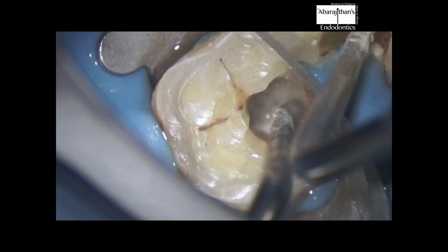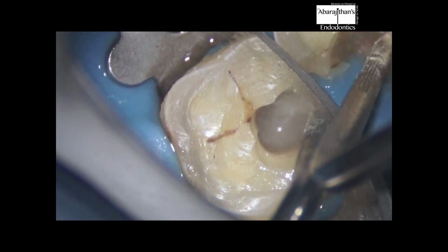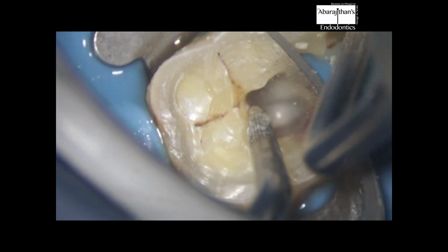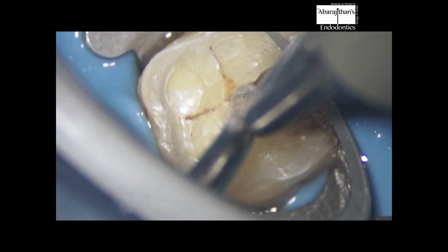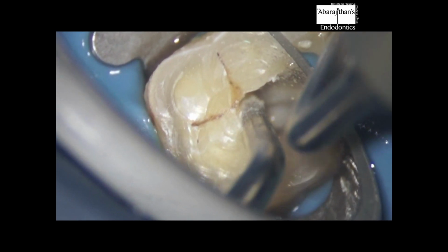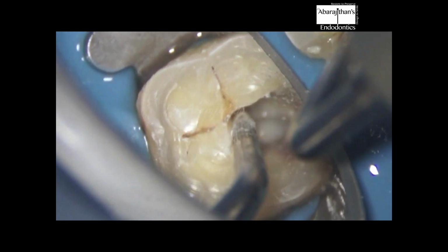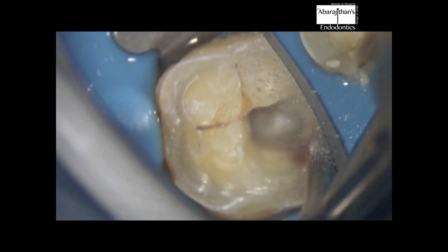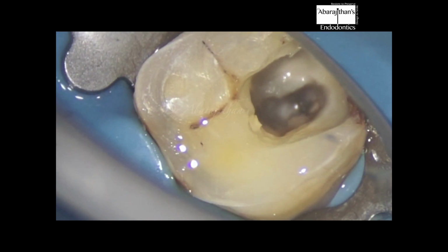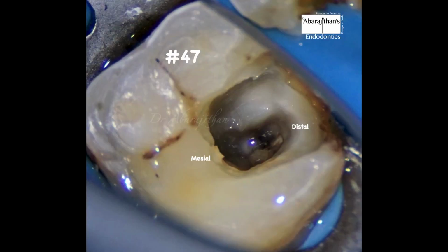So at this stage, we stop using air rotors. We use ultrasonics, which will help me work with vision, and it's very slow and precise so that we don't unnecessarily remove excess of healthy dentin. I'm able to remove exactly where I want to remove. Even caries removal is possible. And at this stage, we stop here.